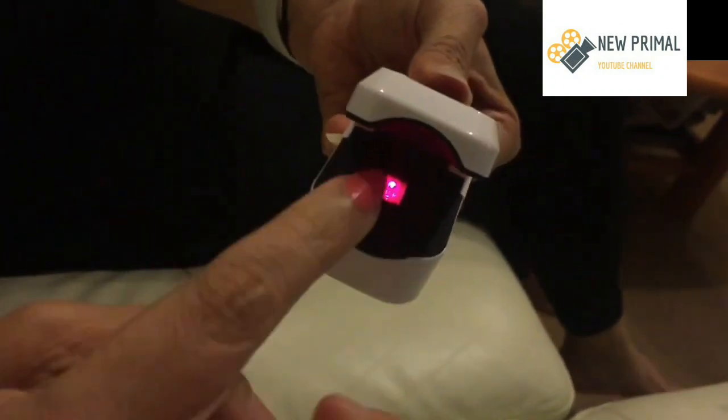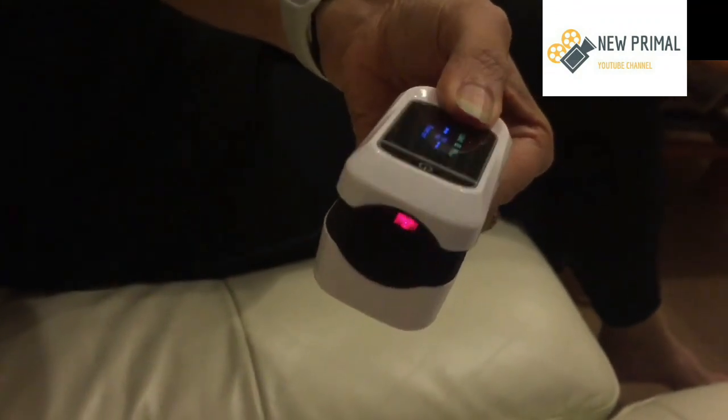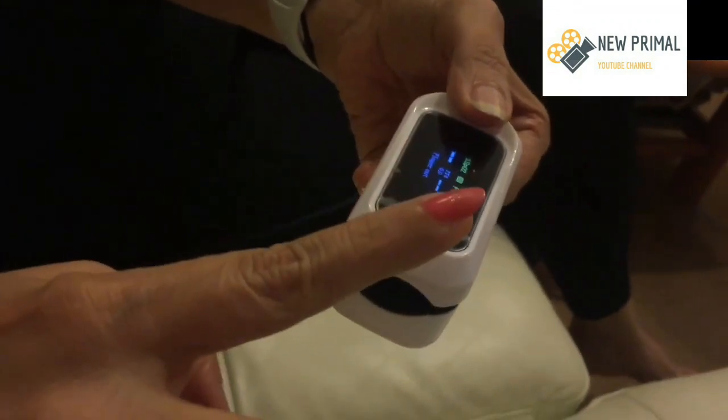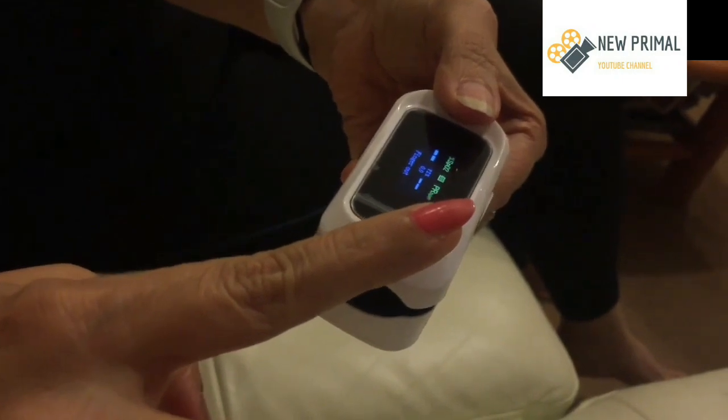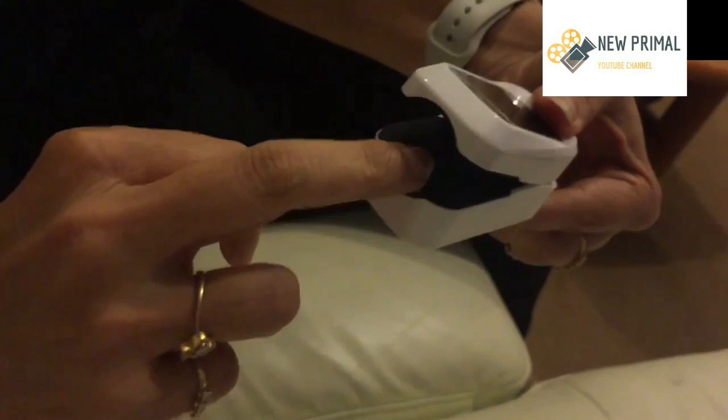You turn on the machine and there is the LED sensor. The finger is inserted into the sensor. That's the wrong finger to insert because it has nail paint on it and it's a longer nail.